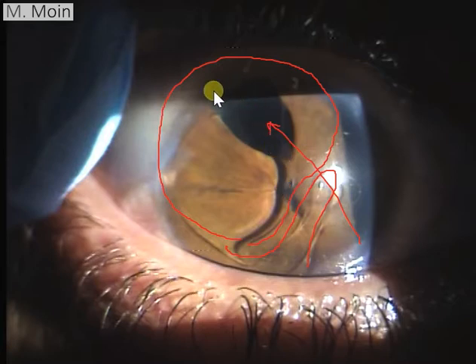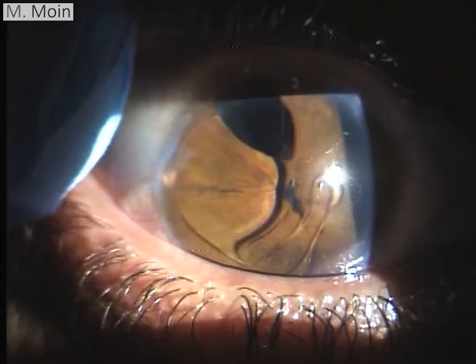We'll find out later. The other thing which we see is an updrawn pupil which is vertically oval, and there seems to be missing iris in the periphery superiorly. There seems to be a limbal wound over here, and in the area where the normal pupil is, there is sort of fibrosis or folding of the iris over that area. So this is an overview of what we are going to see.